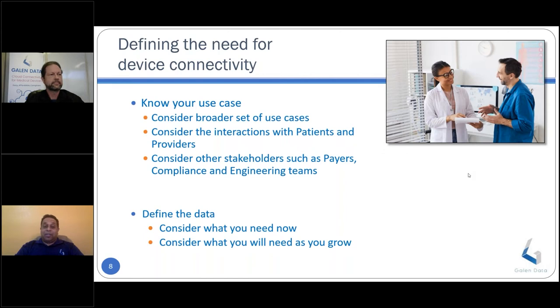Next thing to see is, once you have data, what kind of data will stay on the device, and what kind of processing will happen on the device. We'll talk about some of those later in the presentation. But understanding what data is needed is also important, because collecting data comes with risks, and we'll talk about how you can minimize those. You need to understand the use case, and the data that can back up that use case. That's the key before you start designing your collector solution.